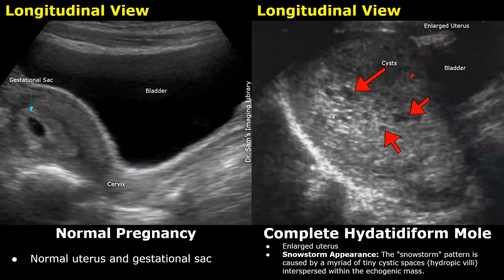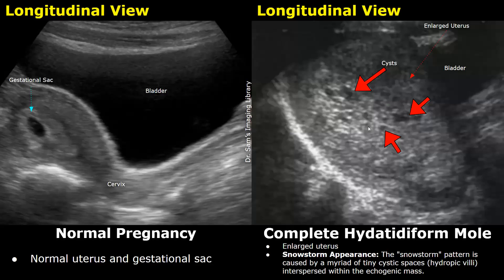This is a transabdominal image in longitudinal plane showing a normal uterus with a normal gestational sac. The uterus is normal in size. In contrast, in gestational trophoblastic disease, the uterus is enlarged and there is no normal gestational sac or embryo. Instead, there is an echogenic mass with multiple cystic spaces in the uterine cavity.